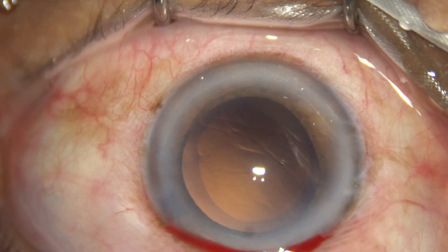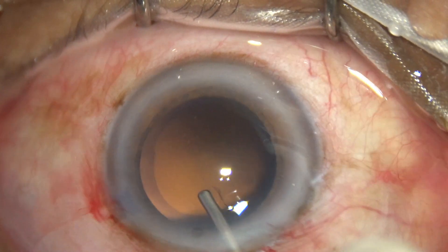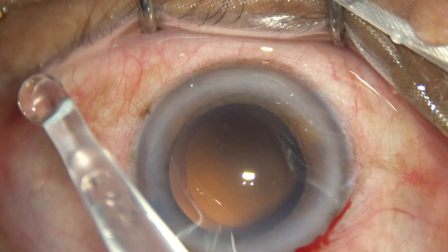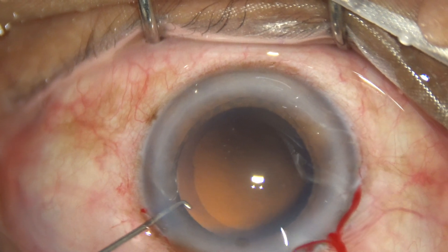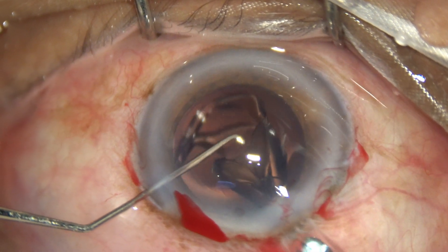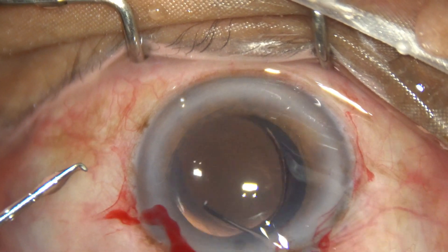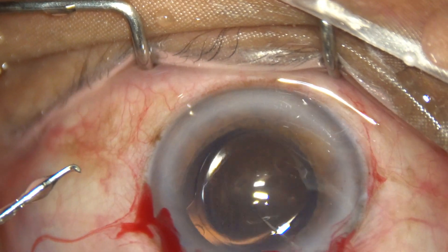Cortical cleanup is completed and viscoelastic is injected to fill the anterior chamber and capsular bag. A single-piece monofocal intraocular lens is then implanted in the capsular bag. The lens is dialed into position and the haptics are placed.